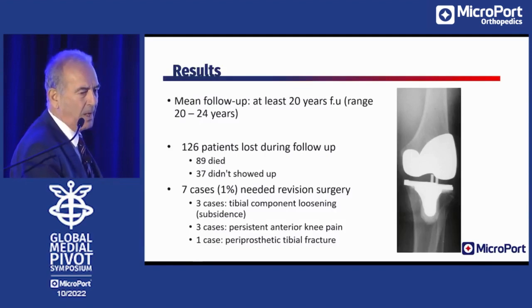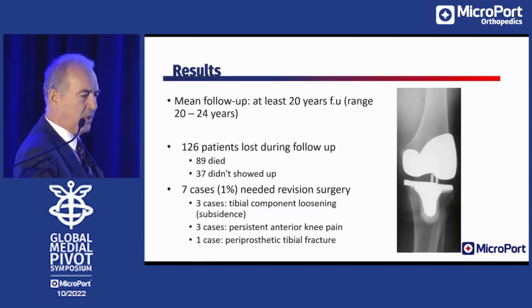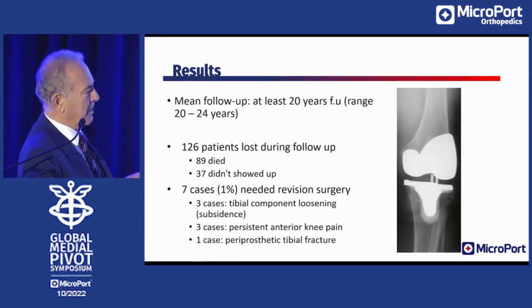The mean follow-up, it's 20 years, minimum 20 years. It's up to 24 years. Of course, we lost some patients. Some of them died, and some of them did not appear. And we had 7 cases of revision, 3 cases for the tibial component loosening, subsidence.